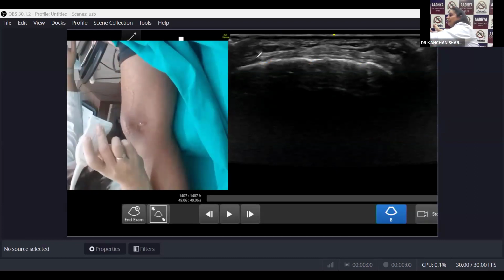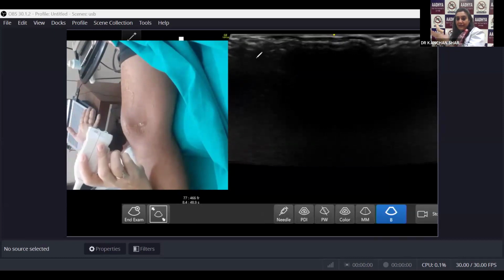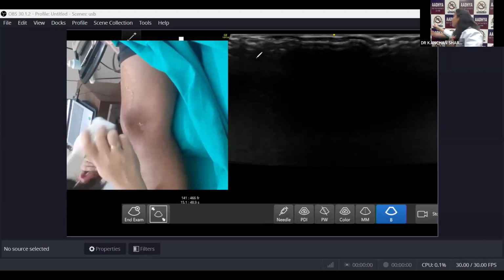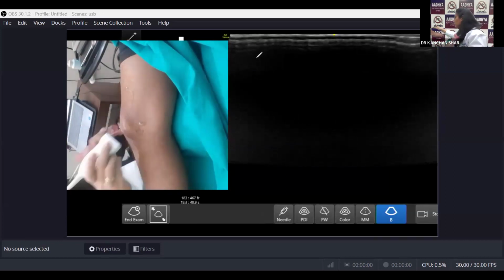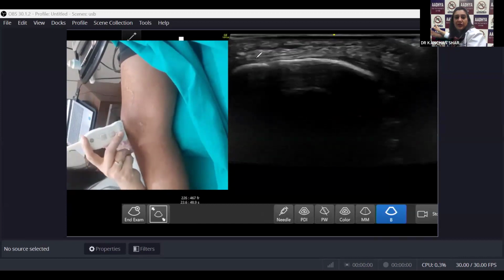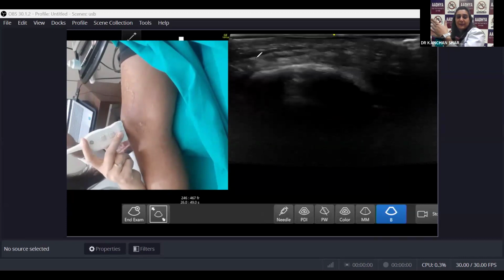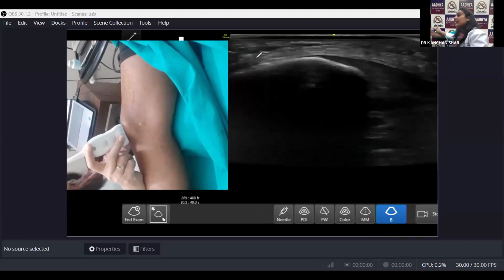So we have now evaluated the quadriceps tendon. We have looked at the fat pad. We have looked at the recess. We have looked at the medial retinaculum, the MPFL. These we have evaluated. We have even evaluated the patella as well, and we have looked for bursal enlargement there also. Now, once you have identified that, we are going to come down. So we'll bring our probe. Again, I'm not changing: my home position will always be my probe in the craniocaudal direction. So I'm looking at the sagittal axis.